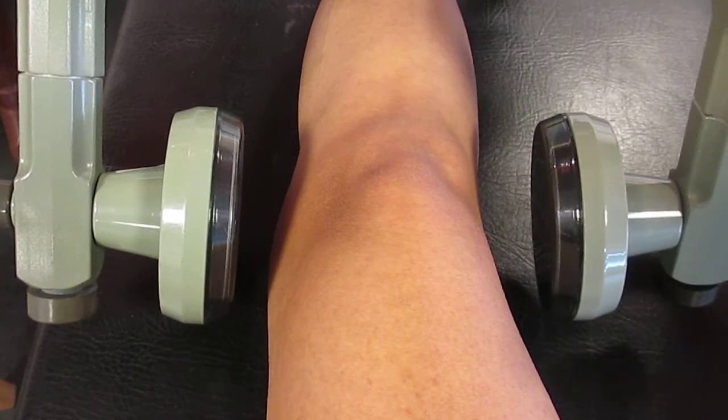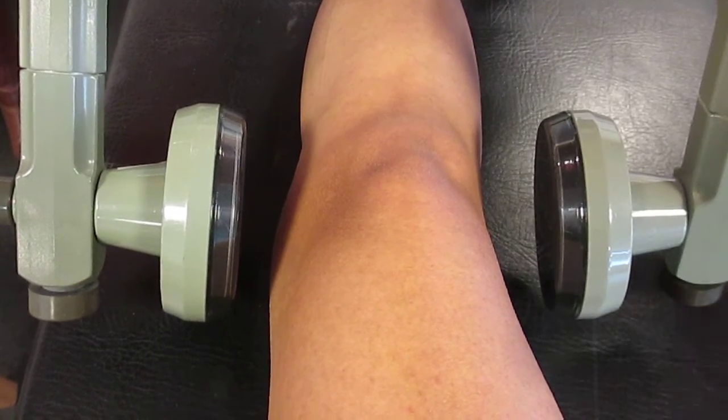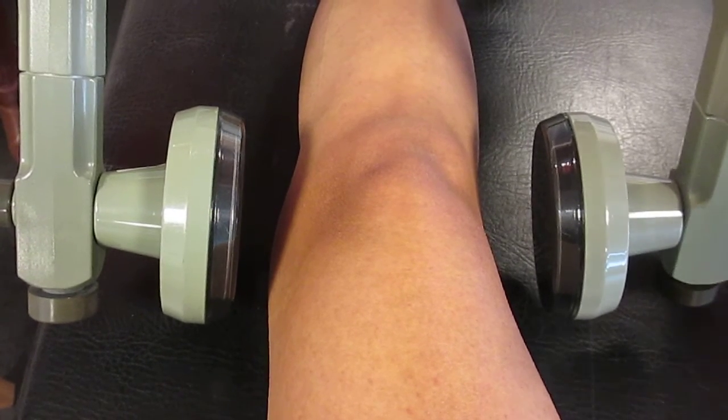Once the treatment's finished, make sure that you turn the machine off and move away. And while the treatment's on, make sure that you're at least 1 meter away from the machine as a therapist to protect yourself.